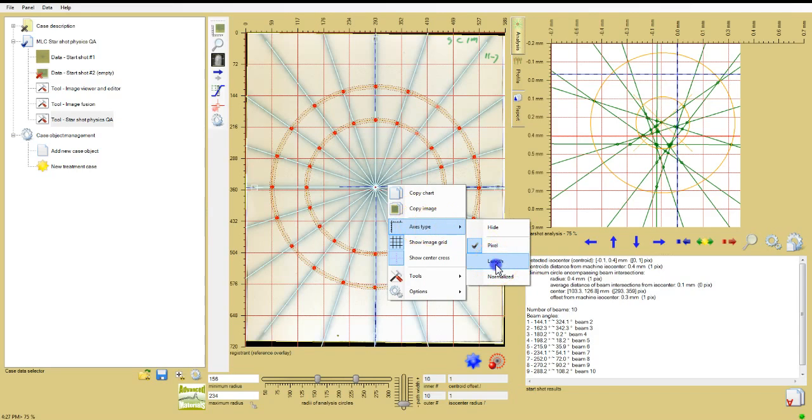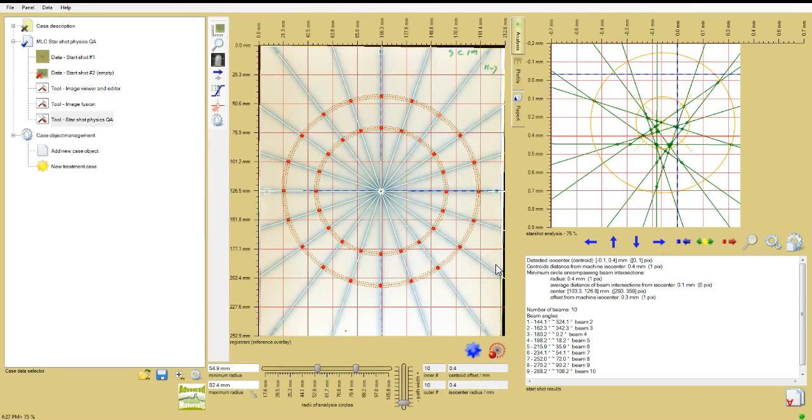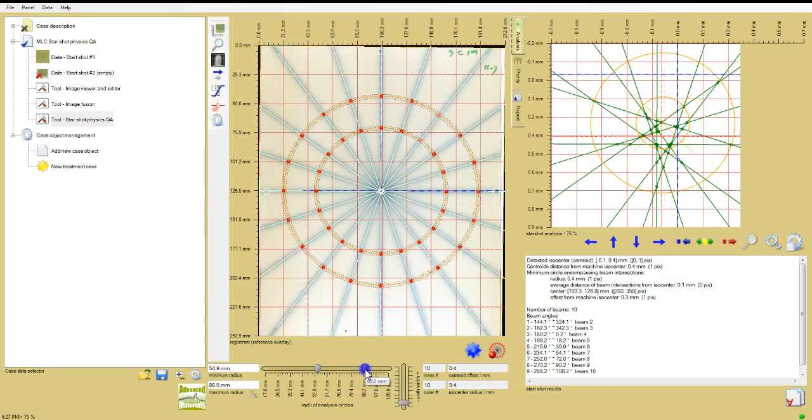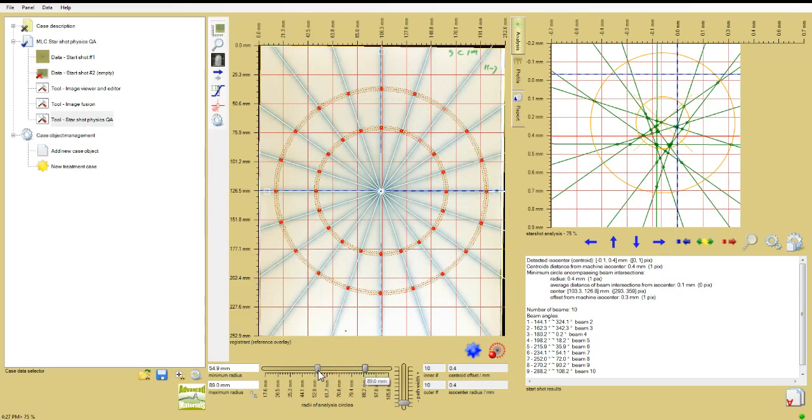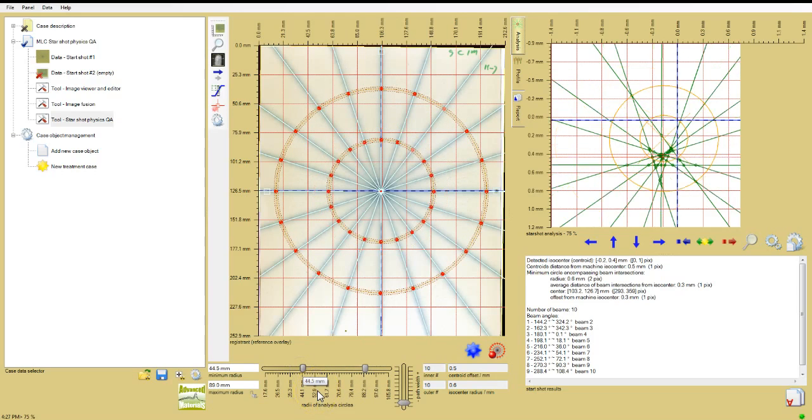Choose the Display Units. Pixels is the default, but length is more familiar. Click Length and choose millimeters or something else if you require. Then use the horizontal sliders at the bottom of the image window to adjust the radii of the analysis circles to about 88 and 44 millimeters, respectively. That's approximately 250 and 125 pixels in this 72 DPI image.